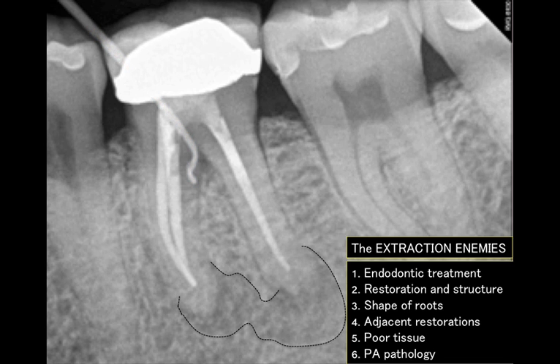Last but not least is the periapical pathology. And you see that there is a radiolucent area around the apex of the mesial and the distal root. Both are potentially communicating. Now, when you extract the tooth, you'll have access to the lesion, be able to debride it with some spoon curettes. Sometimes the challenge is that the lesions embed themselves in bone underneath the furcation bone in an undercut, and it's kind of hard to reach. So we have to use all sorts of small little spoon curettes, sometimes even conventional curette or Pritchard curette to get into those undercuts. And that takes time.